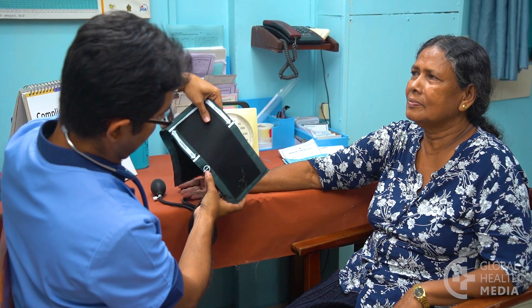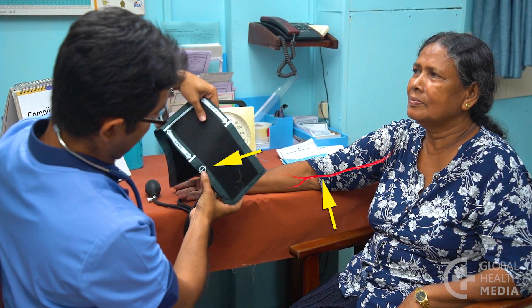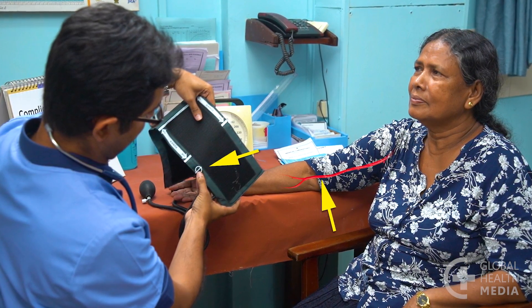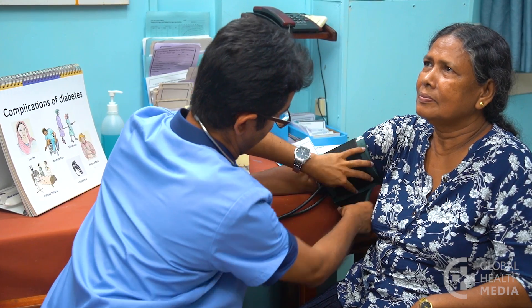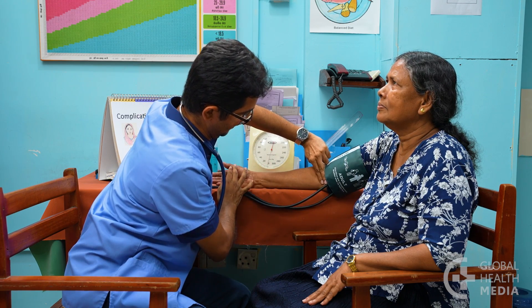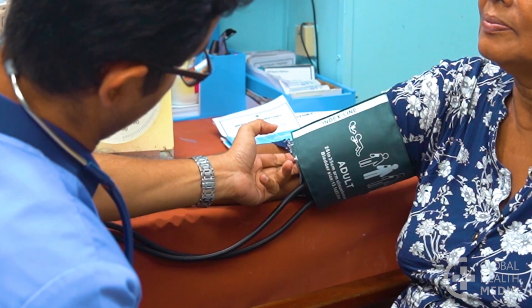Position the cuff by placing the artery mark towards the inside of the arm where the main artery is located. Then wrap the cuff snugly around the upper arm, one or two fingers above the arm crease, with enough room to allow two fingers beneath.